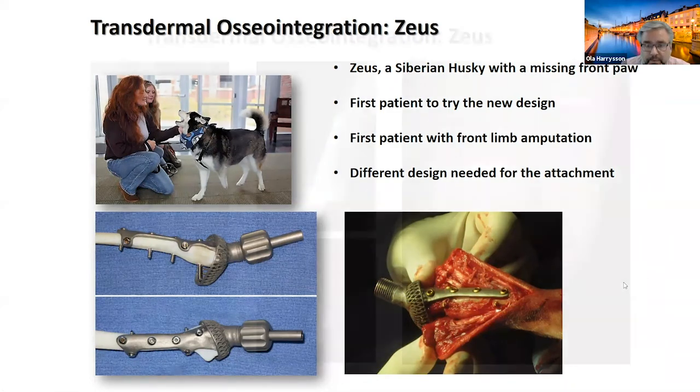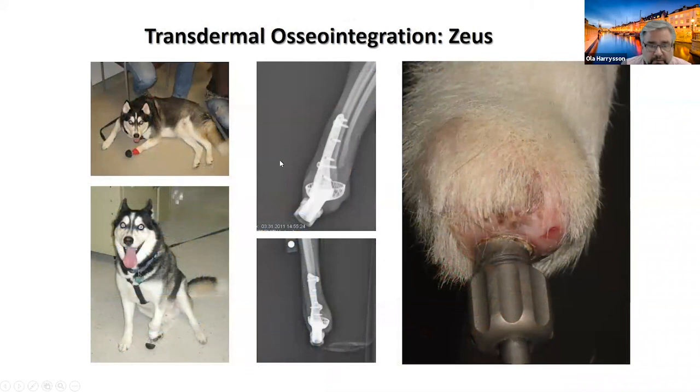and then you suture through these openings here to keep it all together. And here you can see after the surgery, there's only a small piece of this implant that sticks out through the skin. After a couple of months, we've got full healing here. The skin has attached to the titanium surface, so there is no fluid coming out, and there's no bacteria going in either. Then you can have different prosthetics that you're attaching to that piece that is coming out through the skin.